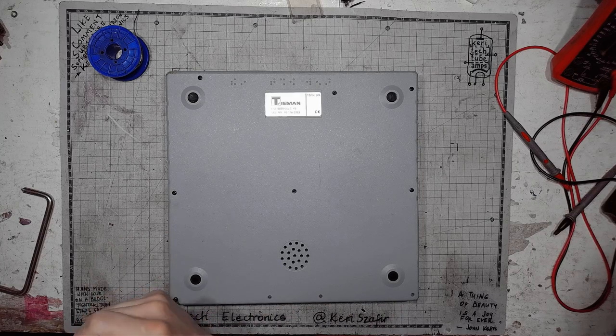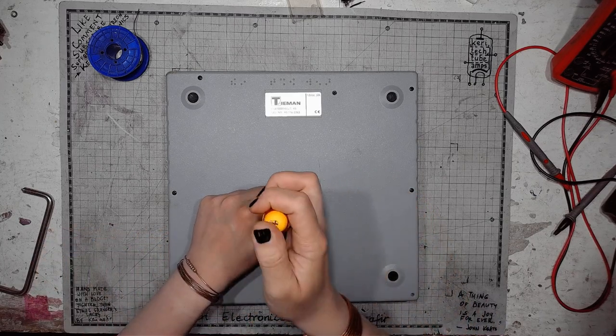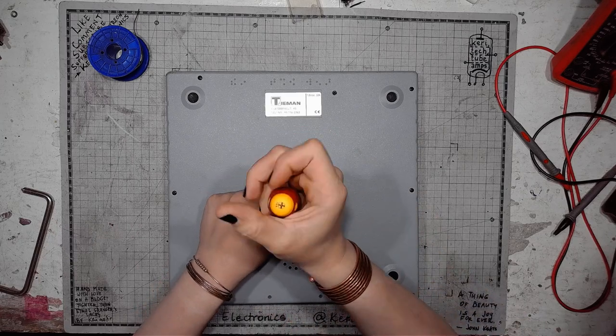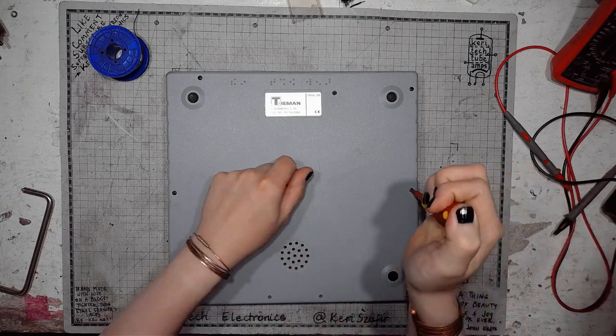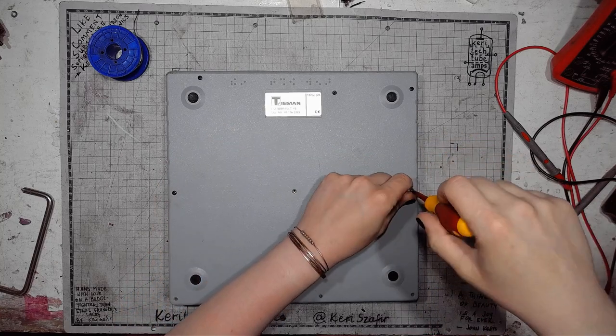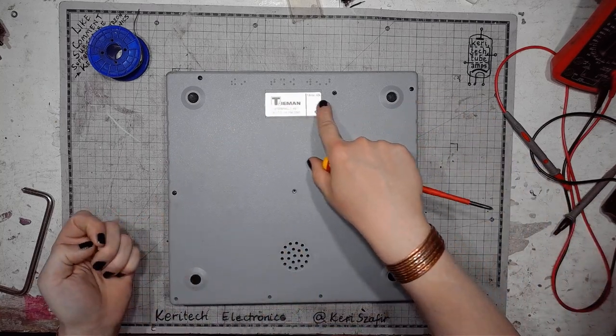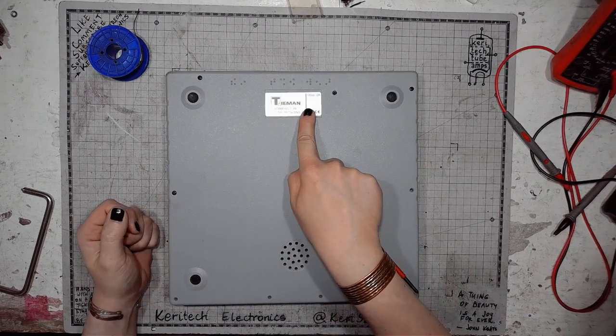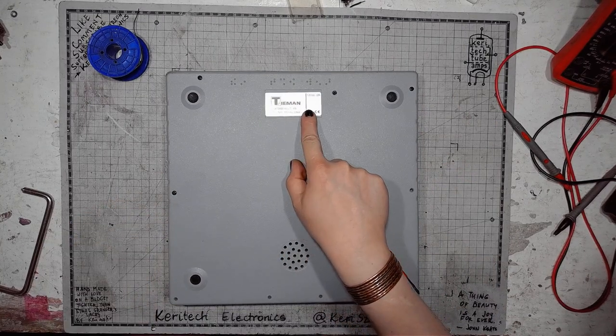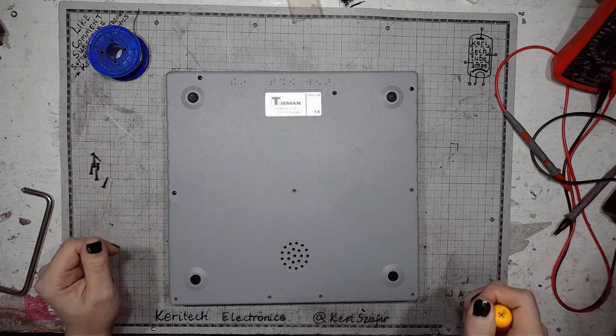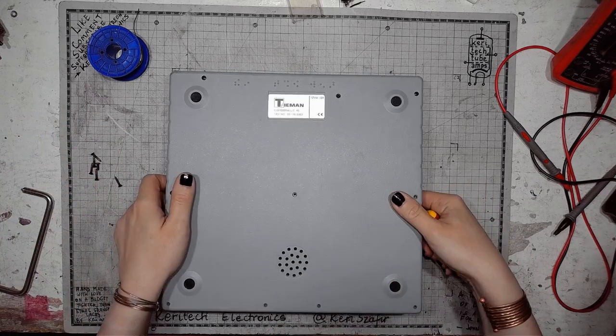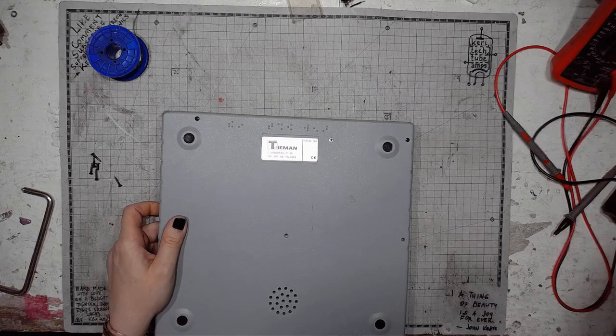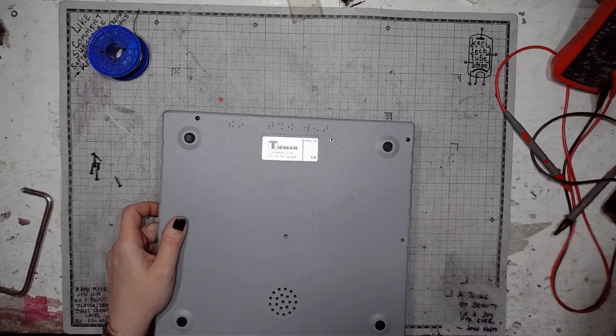The enclosure is made of plastic, not metal, but it's quality plastic. And there's of course the nameplate: Tieman Combi Braille 45, serial number 99.116.0363. So let's get a better view if I can.